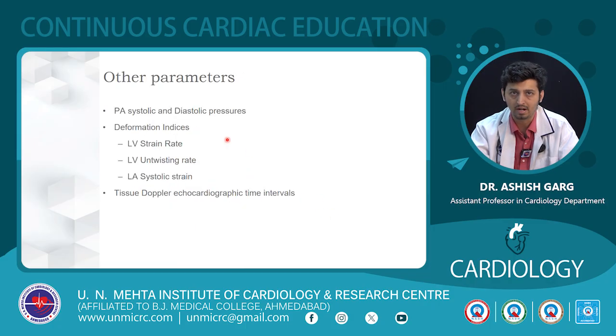There are other parameters like some deformation indices like LV strain rate or the untwisting rate or the LA systolic strain rate.